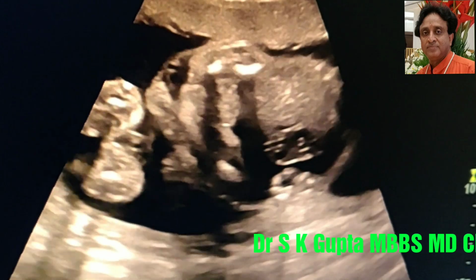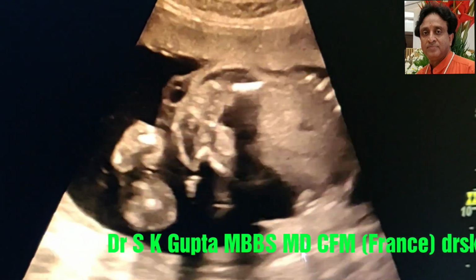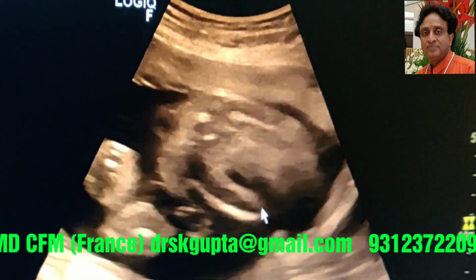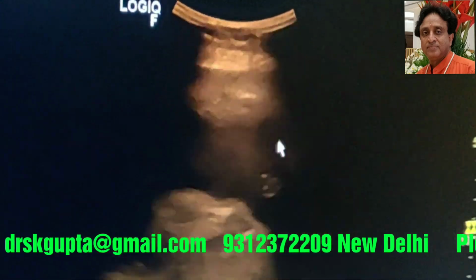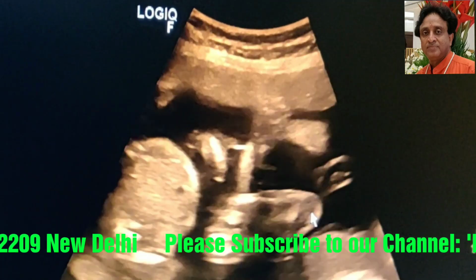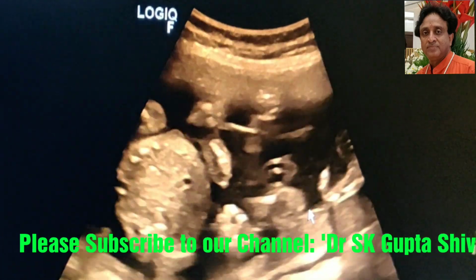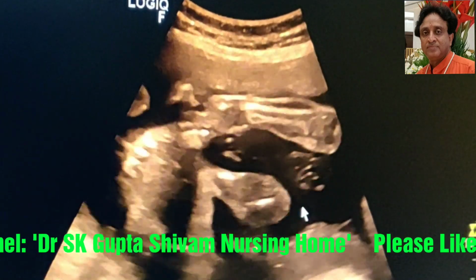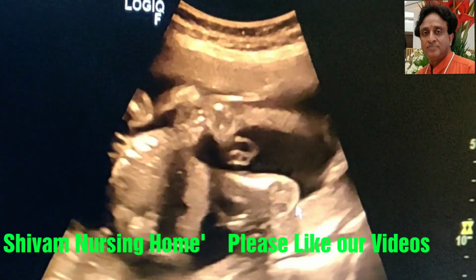This is the scan of the twin 1, and you can see that the twin 1 is normal looking, and this is the cord, which is a 3-vessel cord, and this is the spine, which is normally seen. All the four limbs are well seen. Both the hands and both the feet are visible, and there are apparently no anomalies in twin 1.